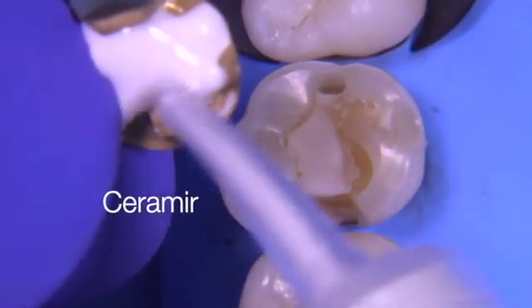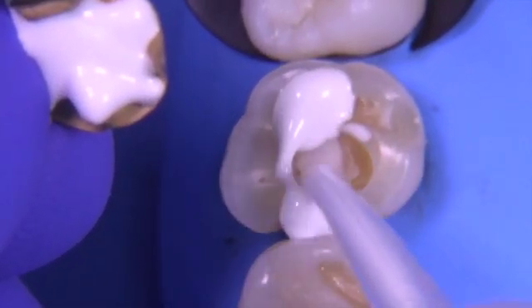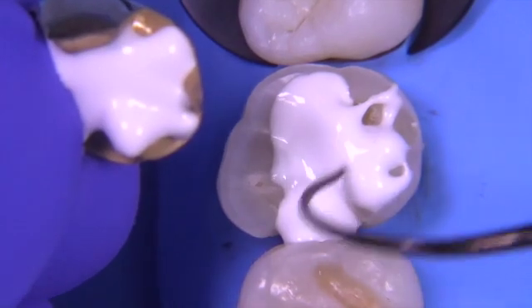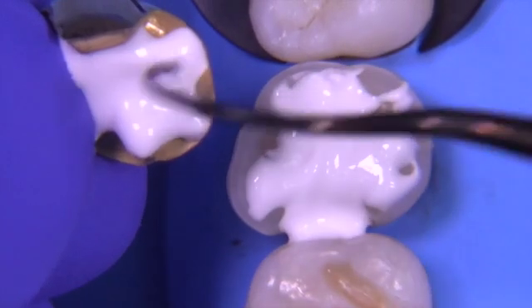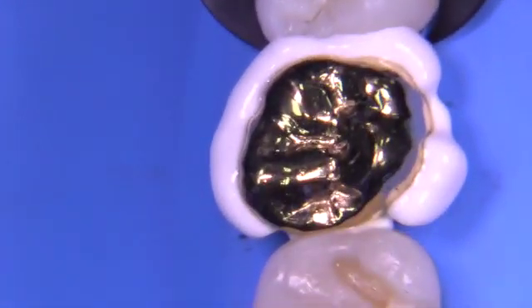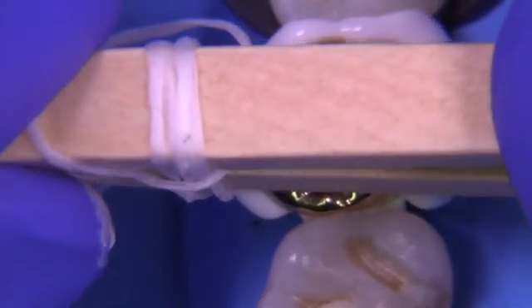We're now going to utilize the cement, and you'll notice I apply it to the casting and to the preparation itself. I want to make sure I've removed any air pockets so it's just completely cement against cement. When cementing inlays and onlays I always do it this way — not so for crowns, where I just put cement in the crown, but for inlays and onlays with all these intricate internal features, it's really important to add cement to both the casting and the preparation.